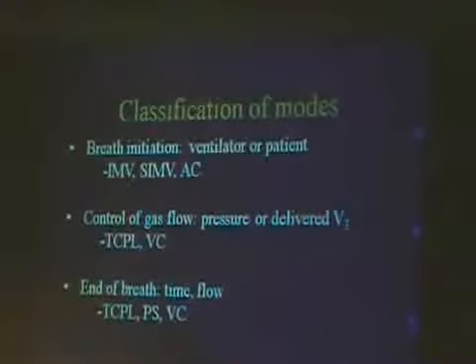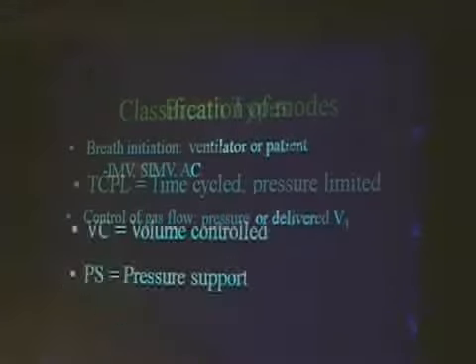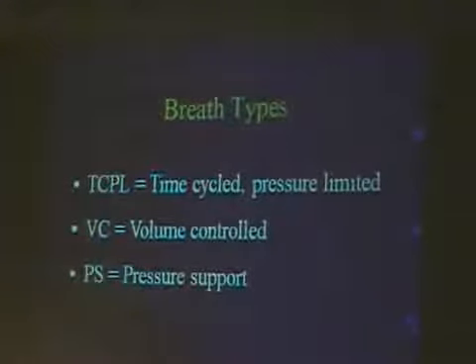Volume control is also flow cycle. We're not going to talk a lot about that because we're not using volume control at this time. So the termination sensitivity that we use, does it require a termination sensitivity at 5% or 10% to end the breath? Or the pressure support will terminate automatically. I think the Avea does it at 25%. Okay. I'm pretty sure that's what it is, but it differs ventilator to ventilator.